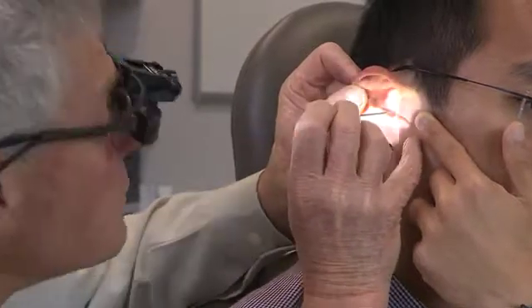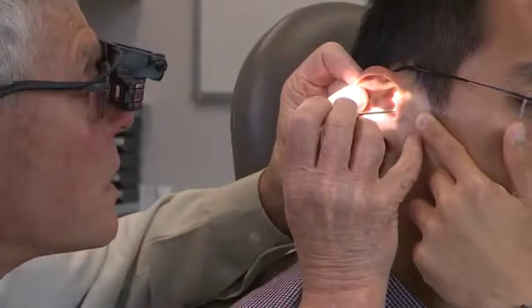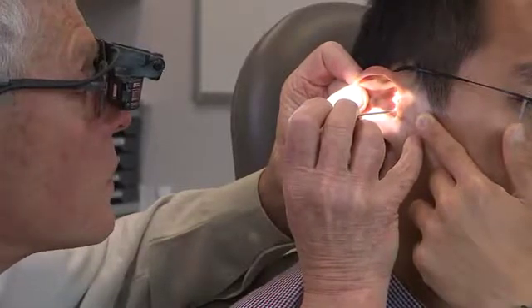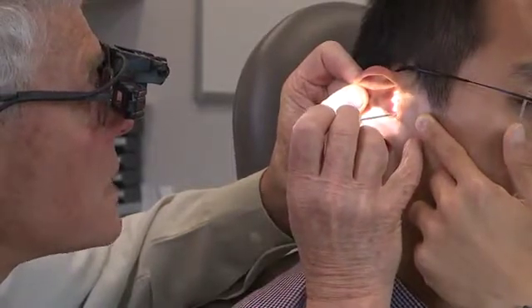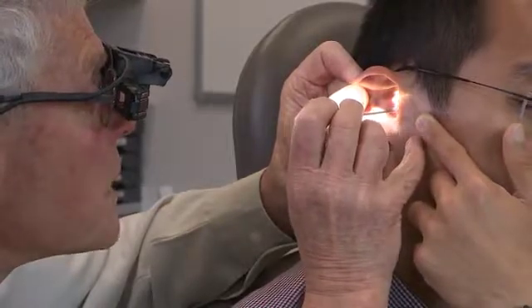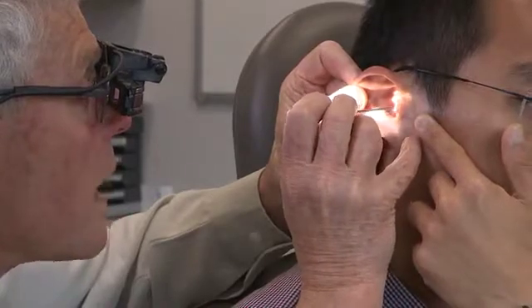When you do get to that bit of wax that you can see well, by shifting your head around to get the best angle, you'll push on it until the edge is lifted up and then it sort of loosens — it lets go. Because if wax is hard to get out, it's because it's adherent to the skin. And if you can unstick it and then go past with your little scoop and bring it towards you, you've got a much better chance of getting it out without hurting.